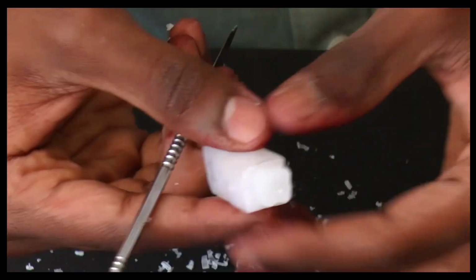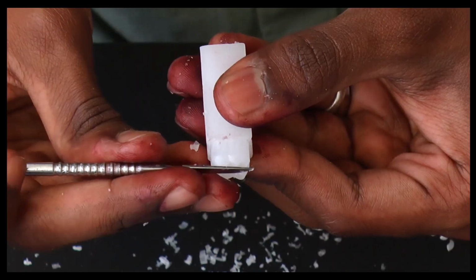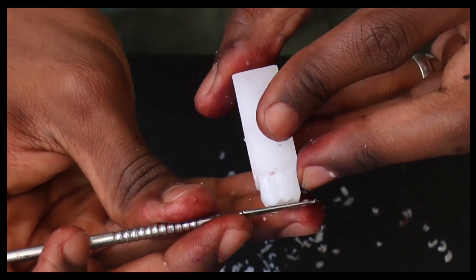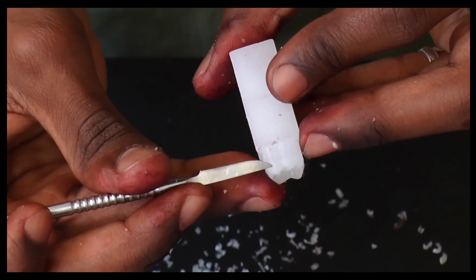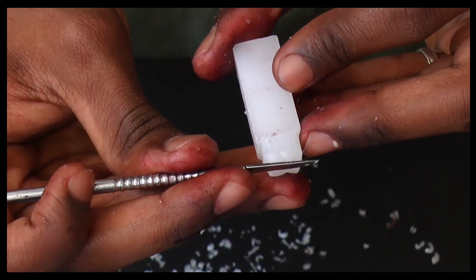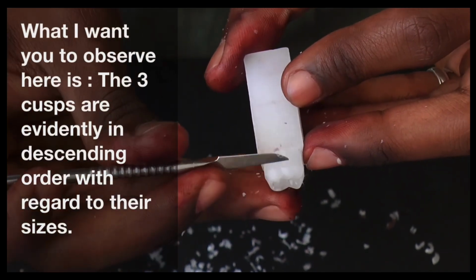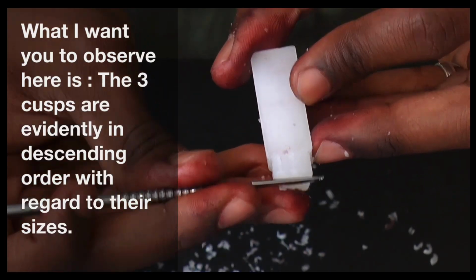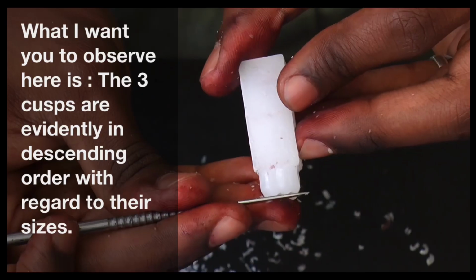And then a very important aspect is that these three cusps are in descending order with regard to height. When you zoom in and see, when I place my Lacron's carver, this cusp is the biggest cusp. This cusp, which is the mesiobuccal cusp, is bigger than the distobuccal cusp, and the distobuccal cusp is bigger than the distal cusp. This descending order with regard to height is very, very important.